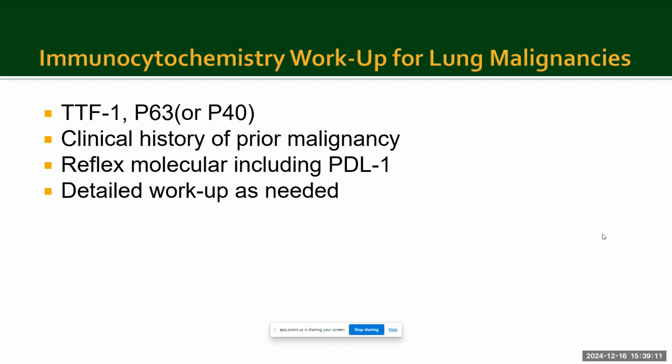So, in this context, what are some of the challenges you as a cytopathologist encounter when applying immunocytochemistry in lung cytopathology?